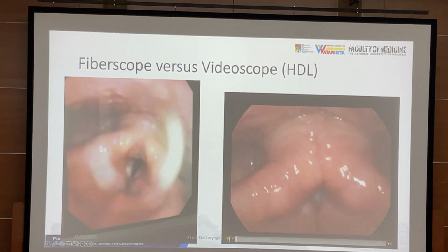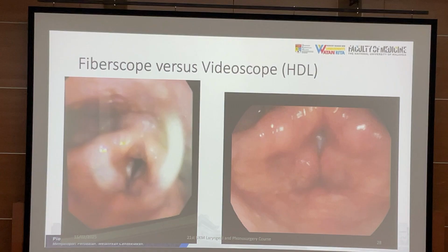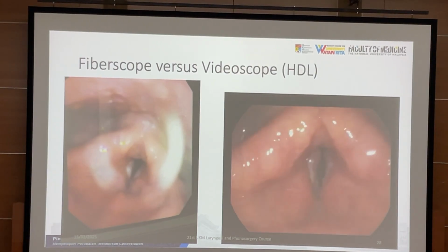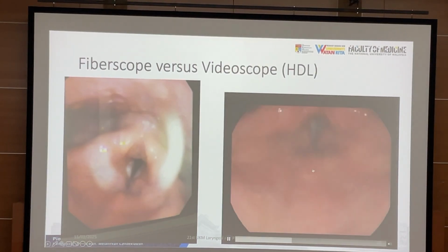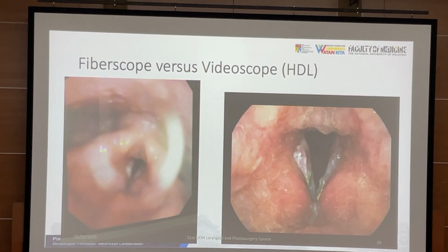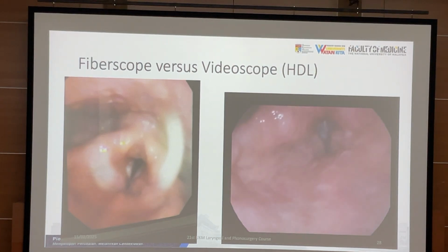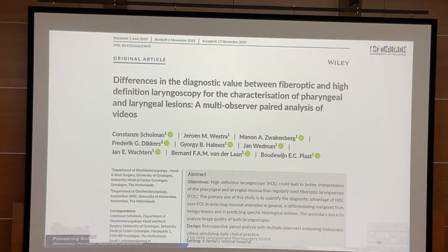This is how his larynx looks with video endoscope. It's clearer and you can clearly see that the patient has an irregular lesion of the vocal fold. And when we turn on the enhanced imaging, you can see even better, and video stroboscopy shows the patient has severe muscle tension dysphonia.